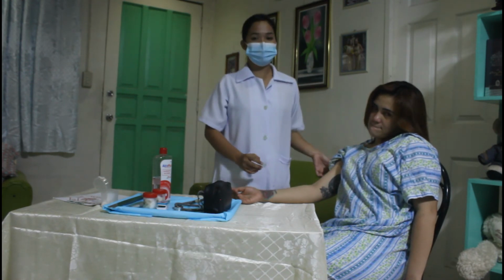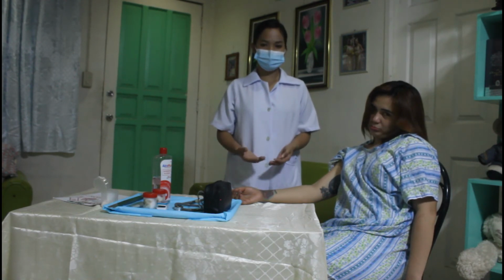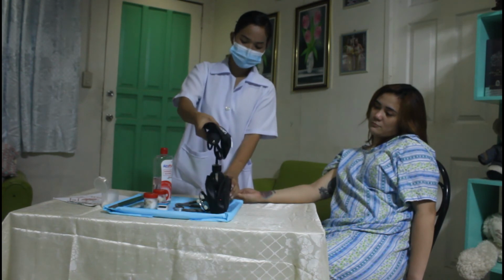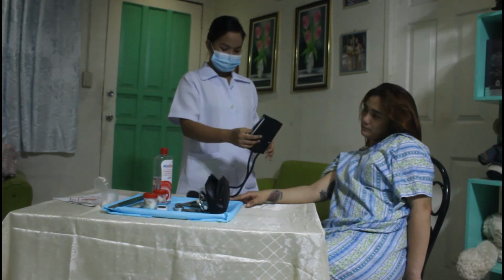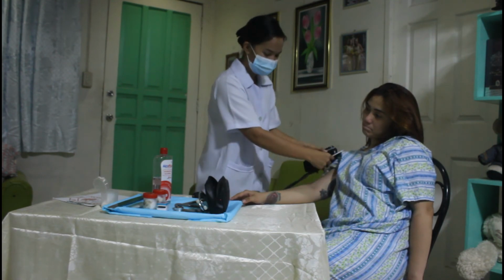So placing arm above level of heart causes false low reading to mmHg for each inch above heart level. So we now get our sphygmomanometer. So since nursing is an art, so we put the cuff like this in a rolling manner.